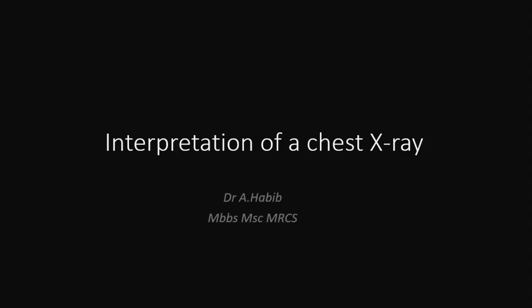Today we'll learn about interpretation of chest x-rays and I hope you find this video useful. So before we move on to interpreting the x-ray, let's cover some of the basics in brief detail.